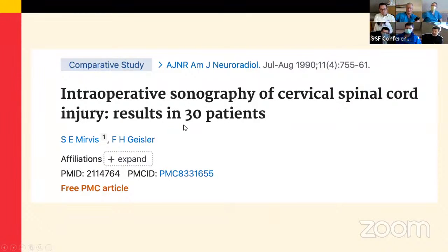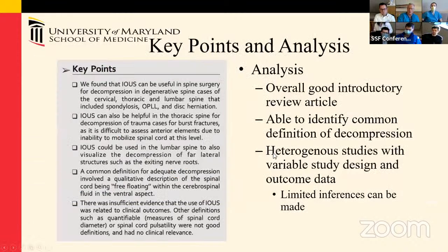Yeah. So thank you for this, and this is a great way to start off with it. So I have a quantitative question, and that is, in this SR, if you kind of quantify the main applications, cervical, thoracic, lumbar, and then indications-wise, what was the distribution? And then the second question is anterior versus posterior. Is there any role in checking corpectomy qualities, for instance, for cervical and thoracics? Was that mentioned? Thanks.